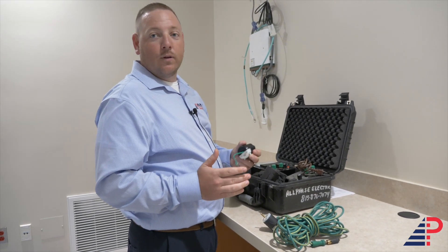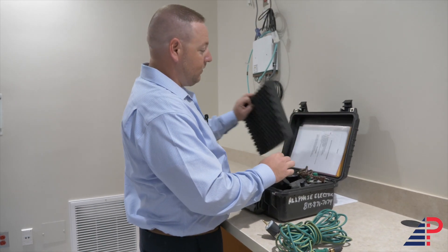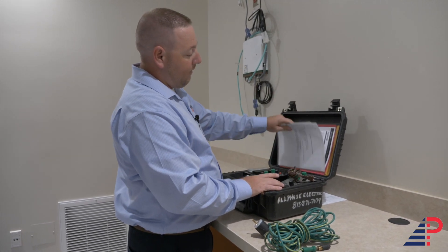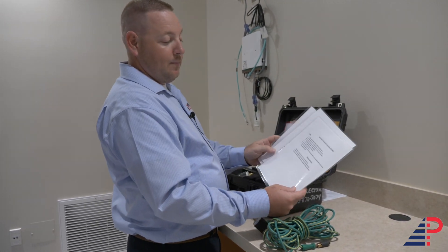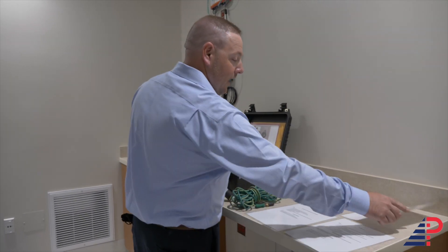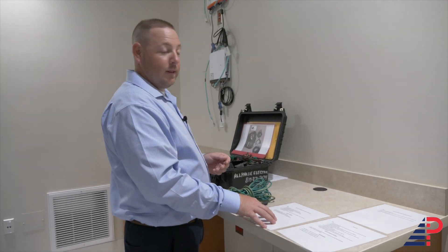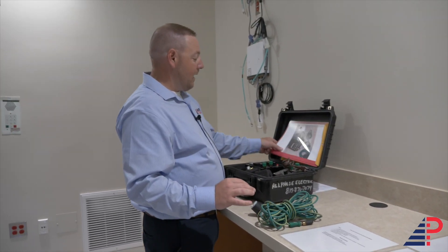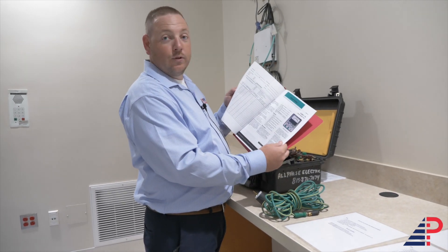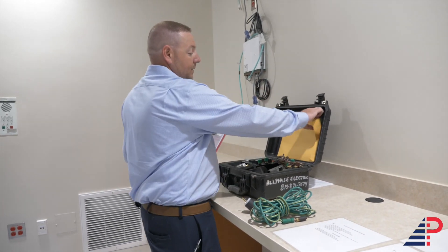Most of the time you'll only see those twist locks in ORs. You're going to pull off the foam piece — behind it you'll have three laminated pieces of paper with directions on how to use each: how to zero and calibrate, how to set up the meter for ohms tests, and how to do millivolt testing. We also have a directions book in case the inspector wants to read the actual directions.